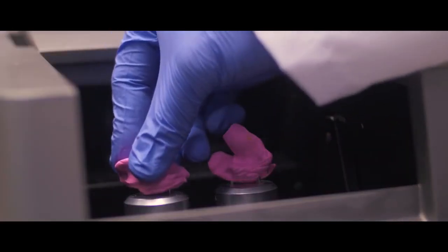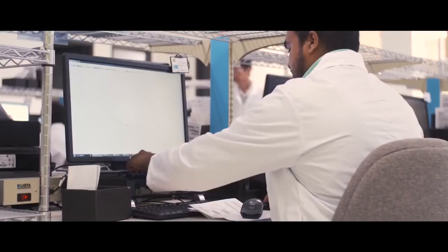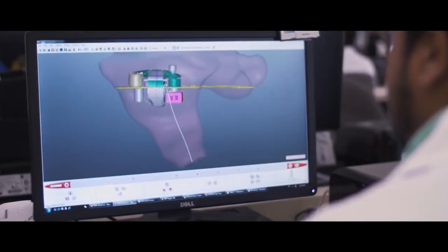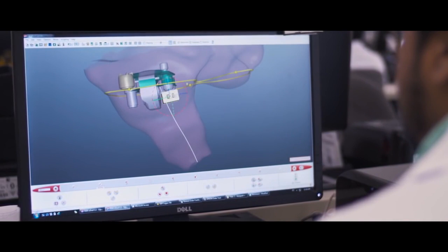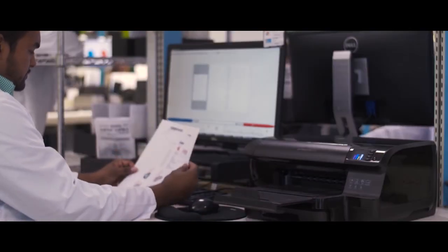My name is Prem Parmal and I've been at Phonak for 3 years now. After order entry is finished, we take the impression and we put it into our 3D scanners. It takes a virtual soft copy of the impression and we keep that on file for up to 5 years. RSM is rapid shell modeling, and here's where we get the soft copy from impression scanning, and we use Phonak's proprietary RSM software, and we basically design the hearing aids from start to finish.